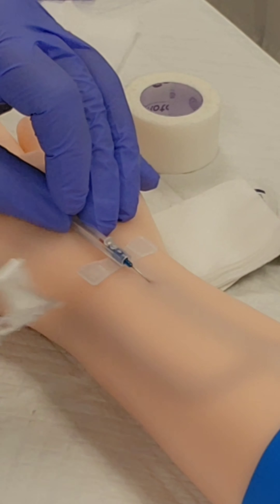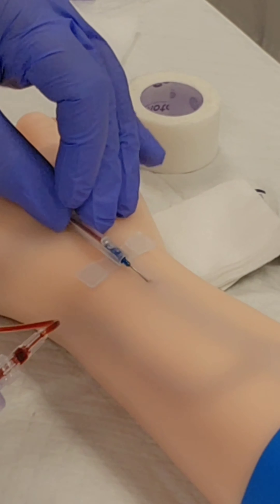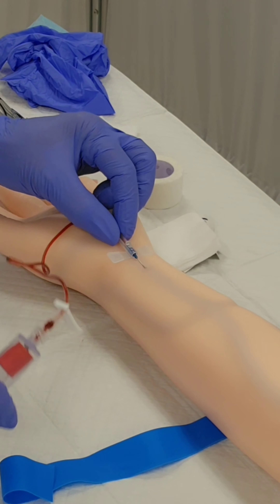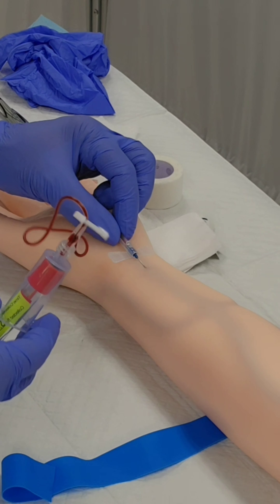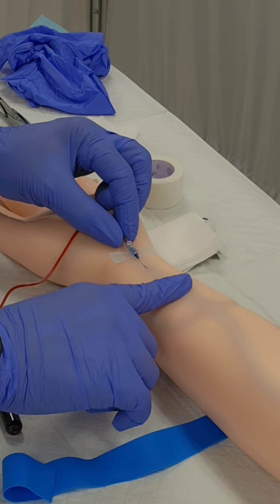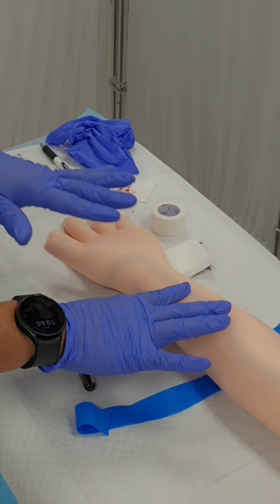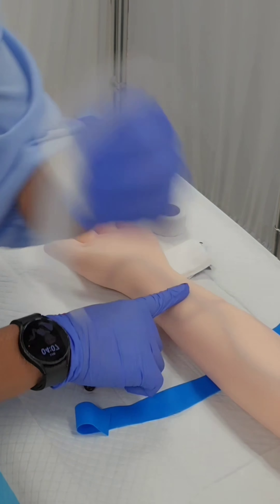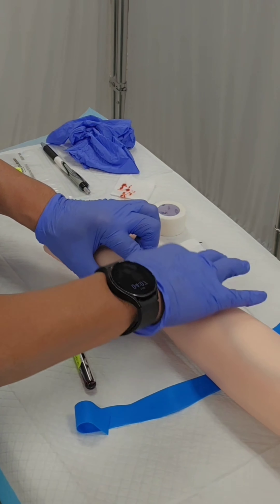Once I get a flashback, I'm going to break the seal on the tube and you can see the blood is now running into the tube. Once I do that, I'm going to secure the needle, release the tourniquet, and continue collecting the blood. Once I've collected enough blood, I'm going to gently press about a half inch above where I've inserted the needle, then gently remove the needle while holding gentle pressure just above the insertion site. I'll take my pre-made dressing, apply it over the pierced area, and apply a little pressure while I secure the dressing.